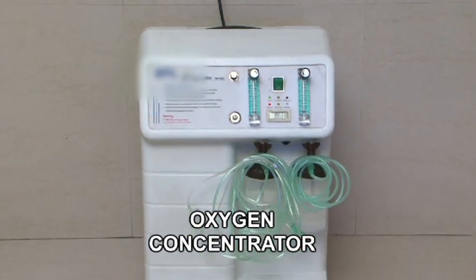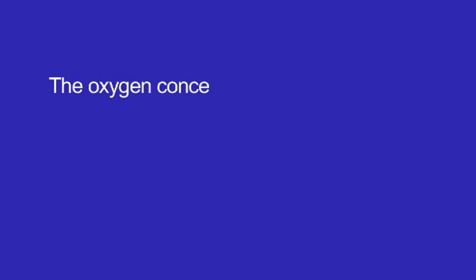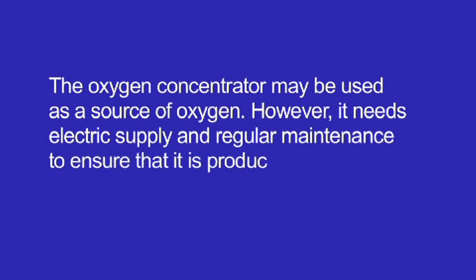Oxygen concentrator. The oxygen concentrator may be used as a source of oxygen. However, it needs electric supply and regular maintenance to ensure that it is producing oxygen.